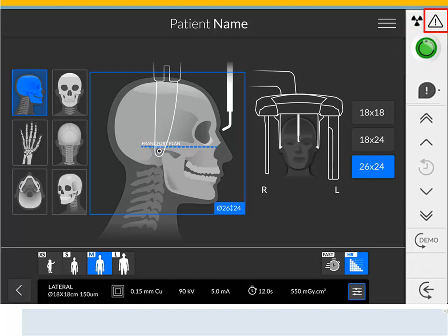Warning will illuminate if there is an issue with the unit or if special attention is needed. Check the user manual if this icon is illuminated. Ionizing Radiation warns you about radiation dangers. Blue indicates the X-ray is enabled; Gray indicates the X-ray is not enabled.